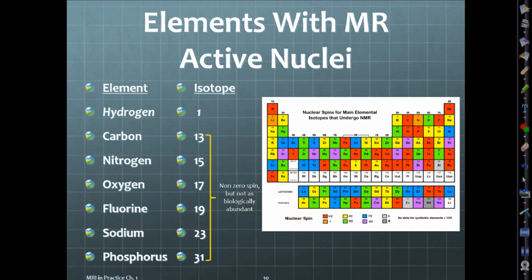So what's cool about the future of MRI is as we get stronger and stronger magnets, we're actually now able to excite these isotopes and image specifically carbon or nitrogen or oxygen. Because we have the field strength now, like 7 Tesla, 13 Tesla, in these lab settings, where the strength of the magnet counteracts the small abundance of that particular atom.